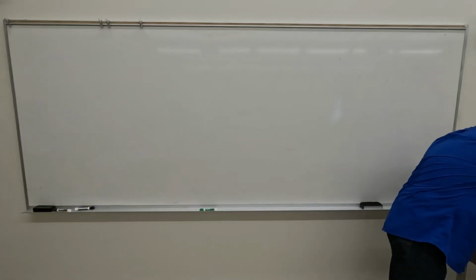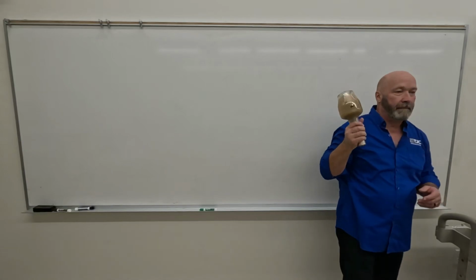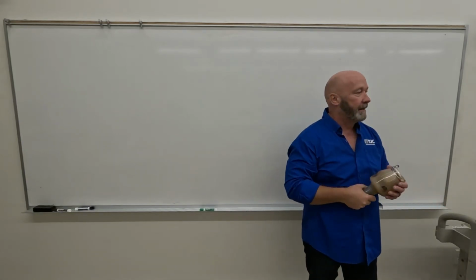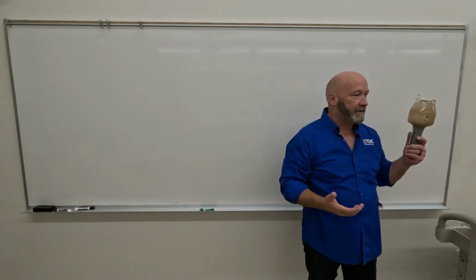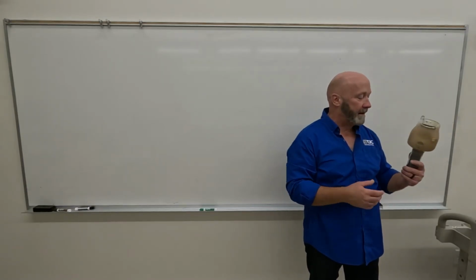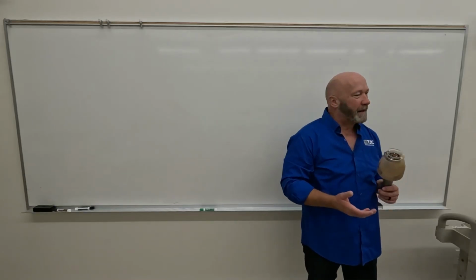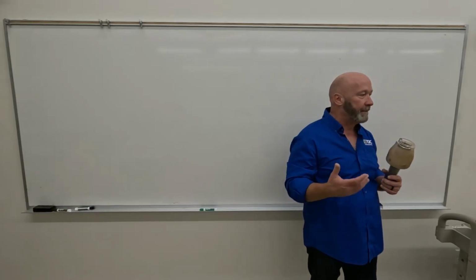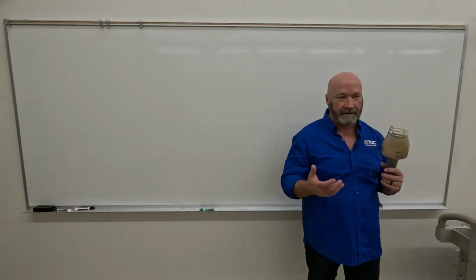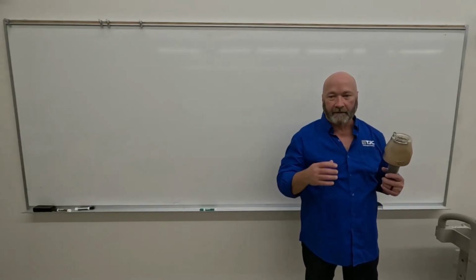This is the X-ray tube itself. So this is an intact X-ray tube. Be careful with it because it's glass, but it's also a vacuum tube. I don't know how we got this. It's been here as long as I have, or longer than I have, but if you look at it, it looks like it's never been used. So I don't know how we got it. I don't know if it was just a bad tube to begin with, and they took it out of the machine, replaced it, and then they gave it to us. Most of what we have is because somebody gave them to us.